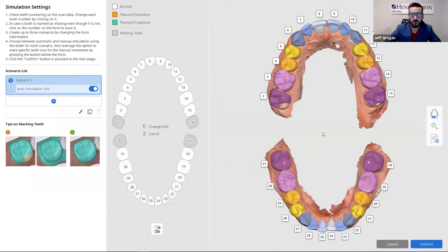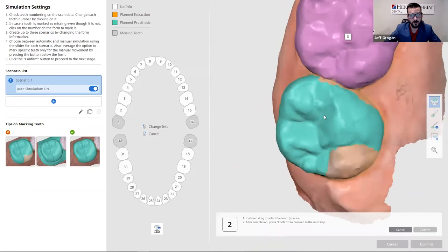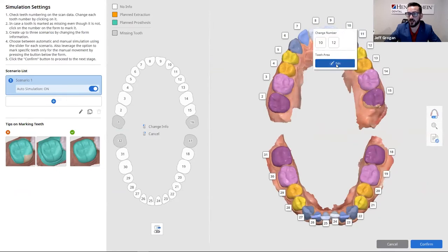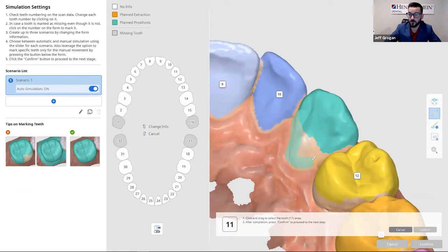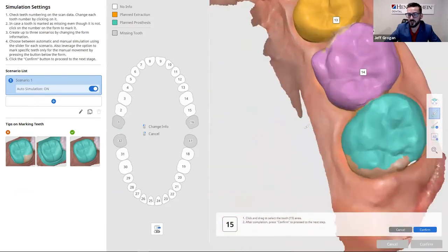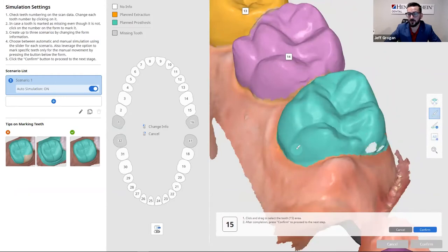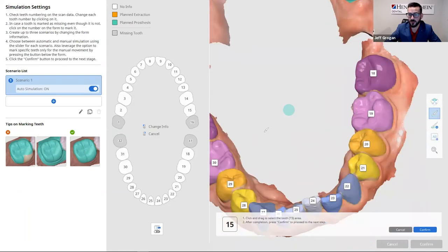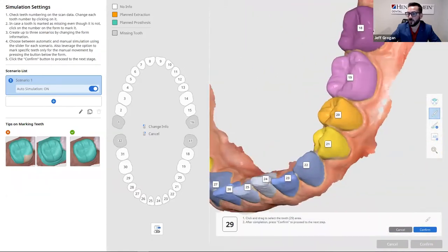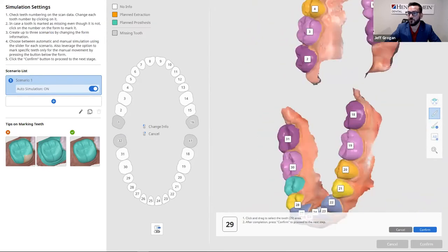The next step in Medit is to go through and analyze the segmentation of the teeth. The software did the majority of the work, but I may need to tweak where it segmented tooth or teeth. I can quickly go through and re-segment different parts to get an accurate simulation. By clicking on each tooth, I can use the add or remove tool to further accent or remove what the computer put together.